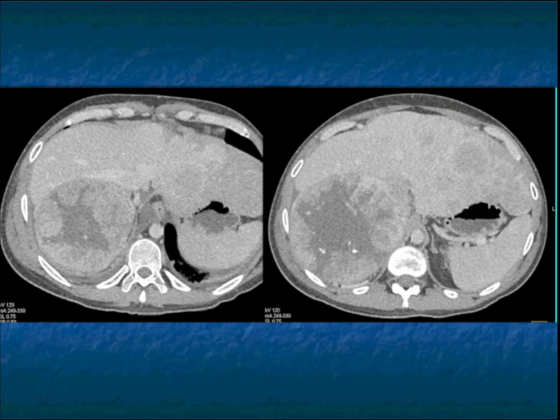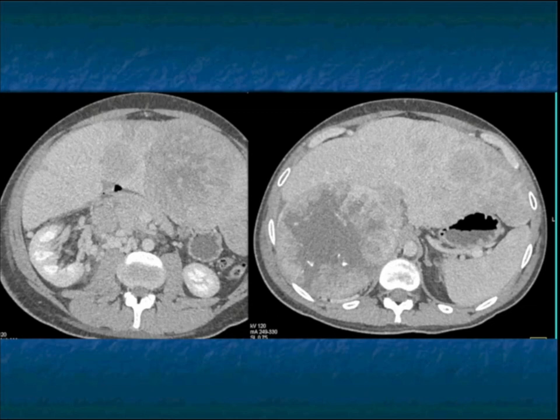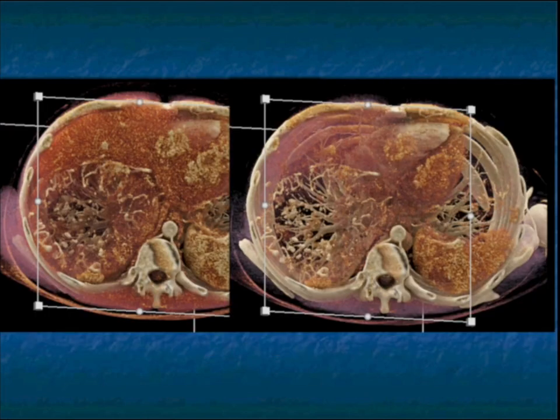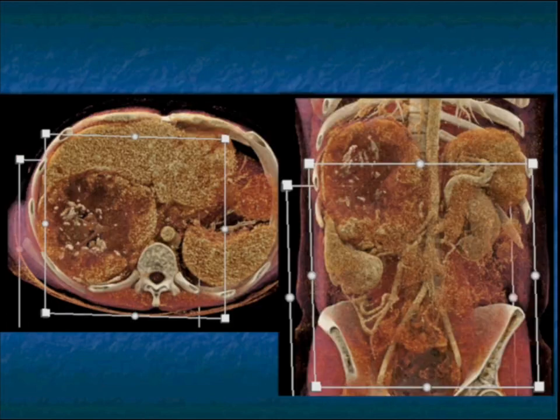Here's the venous phase imaging. You can see the liver lesions are still seen, but not as well seen, and they wash out. But again, no great difficulty in making the diagnosis. And again, looking at the venous, looking at the necrosis, you would wonder, looking simply at this lesion, could it be liver? It's a pitfall, but it's something you should not make the mistake of when you look at all of the images.